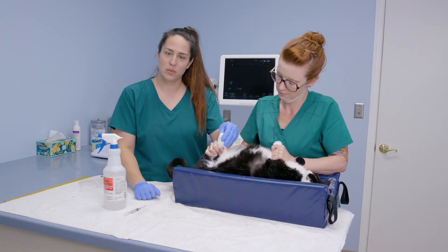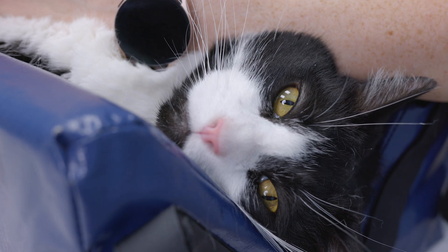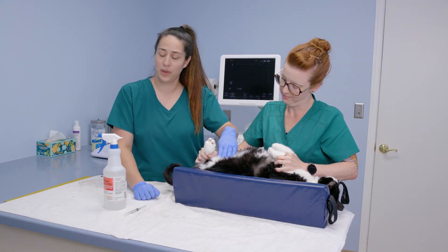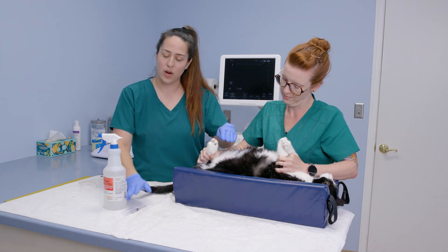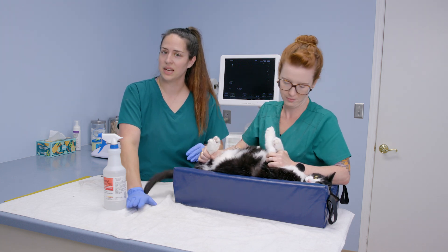We want to make sure that we're wearing gloves to help keep the procedure sterile. We want our patient as comfortable as possible, so we'll spray the area down to visualize the bladder with the ultrasound probe while also keeping that area clean before we start putting our needle into the skin and into the bladder.